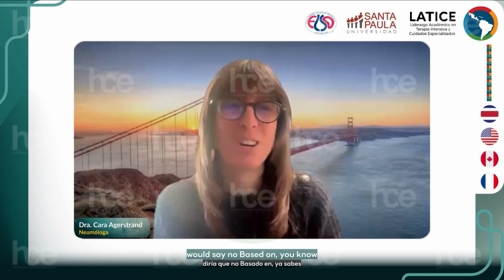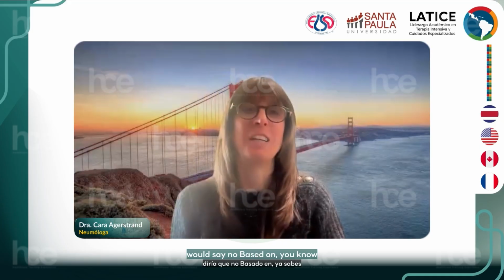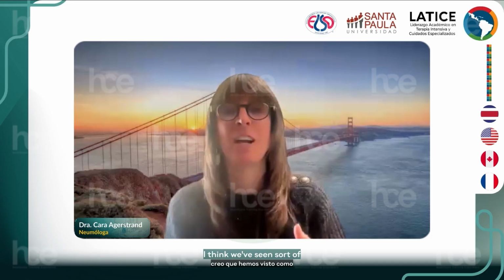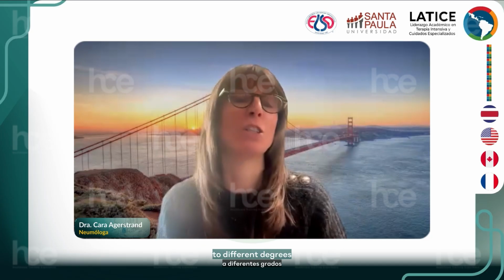There's a question here. Is there a limit of BMI for ECMO cannulation? I would say no, based on our understanding of ECMO over the last 15 years. I think we've seen that envelope be pushed to different degrees.